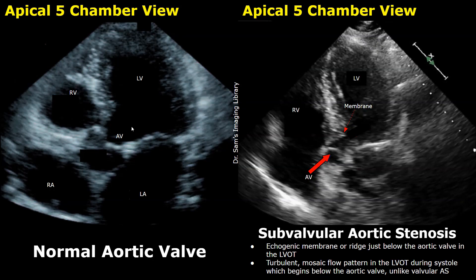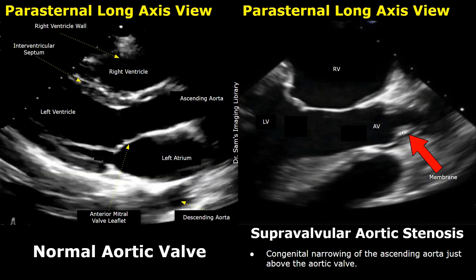In supravalvular aortic stenosis, a similar ridge or narrowing is present above the aortic valve. This narrowing is also congenital and rare, and will be seen as an echogenic structure in front of the aortic valve on echocardiography.